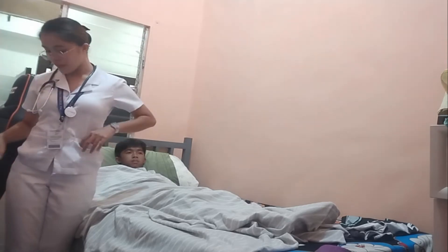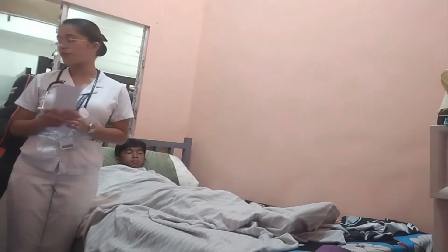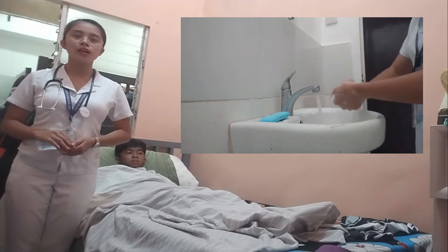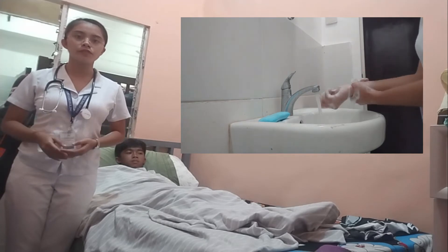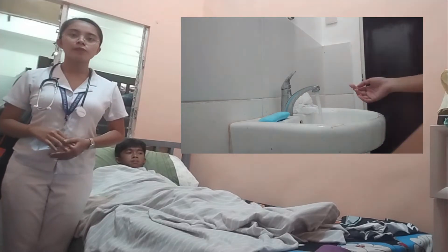The equipment I will be using today are the following: a pen light, a stethoscope, and two long objects or two centimeter rulers. After preparing the equipment, I performed hand washing and observed appropriate infection prevention, to protect the client as well as myself from the spread of microorganisms and other illnesses.